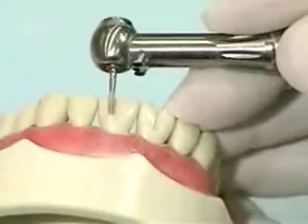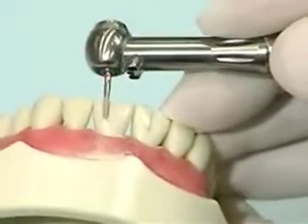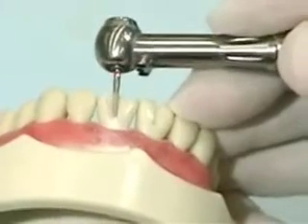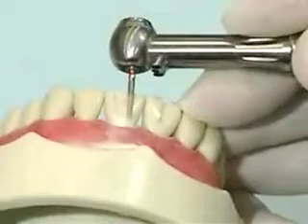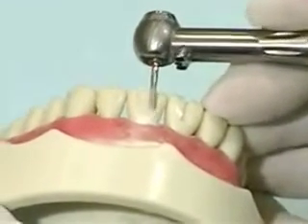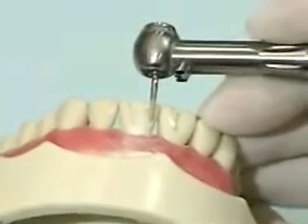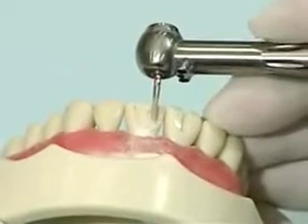Starting on the mesiolabial surface and moving toward the distal, create a 1 millimeter shoulder all the way around the tooth, always keeping the tip of the burr diamond parallel to the surface that you are working on. Remember that this will be a supragingival prep, meaning that it ends above the gum in order to avoid damaging the gingiva. This preparation should end approximately 1.5 millimeters above the gum.